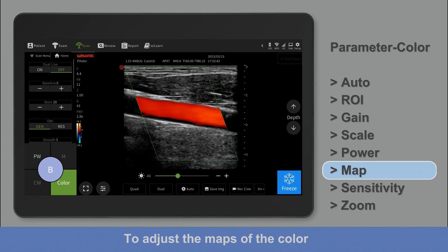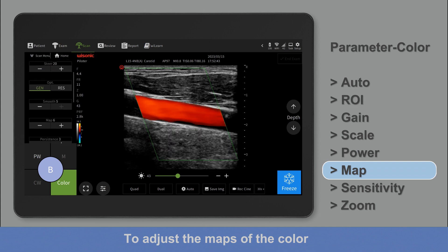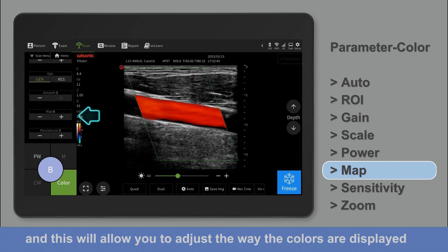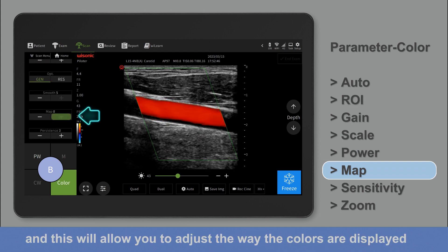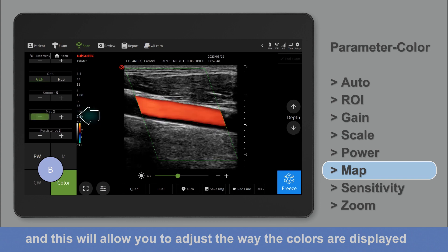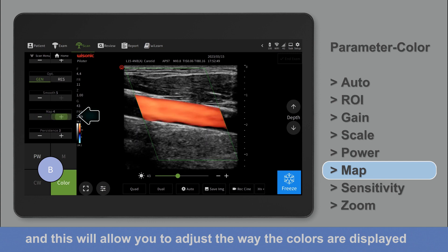To adjust the maps of the color, select map. This will allow you to adjust the way the colors are displayed.